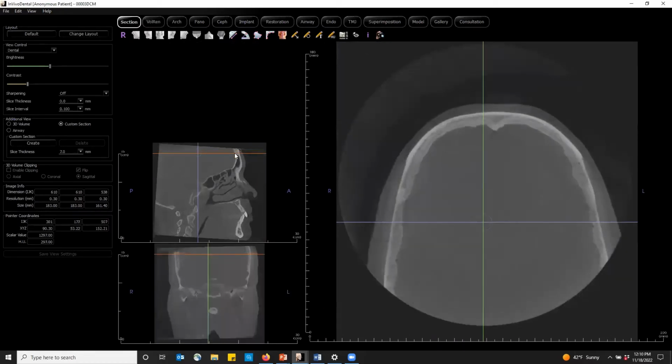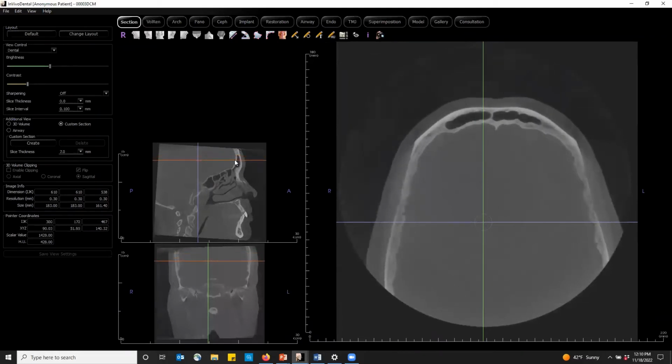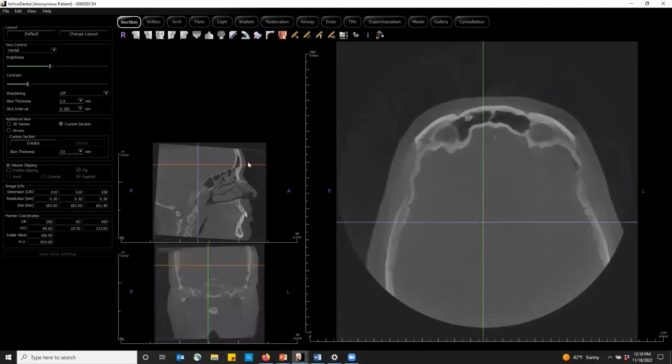As you're scrolling through here, obviously we're just trying to check that frontal sinus. You can see along here. And as you scroll down, right here, you can see we've already found one incidental finding. Nothing super concerning, but this was a nice, well-defined radio hyperdense entity here, which is indicative of an osteoma. I put it in my report, but again, it would be something very benign that wouldn't be very concerning.